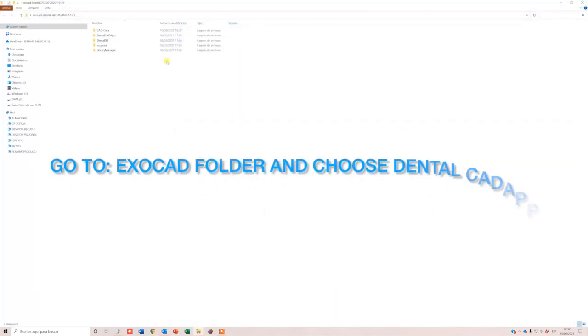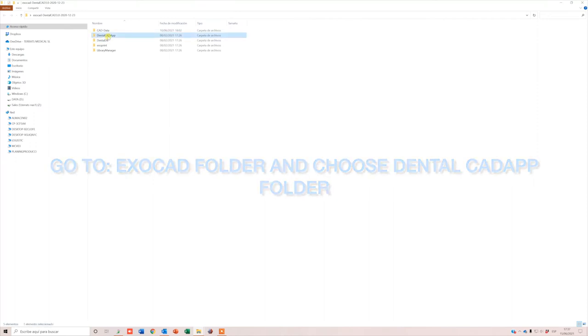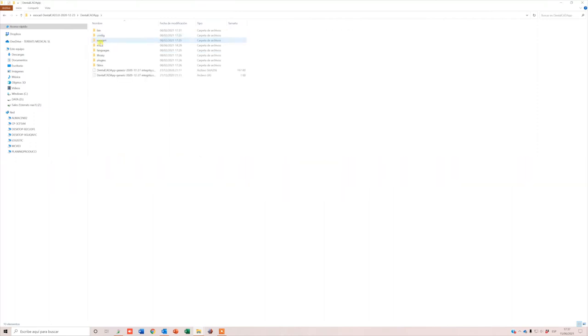Go to the Exocad Dental CAD folder. Open the Dental CAD App folder, go to Library, Library.